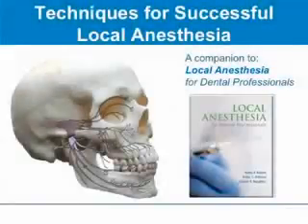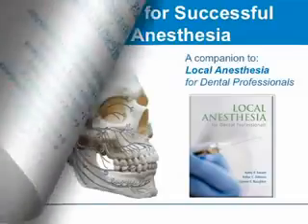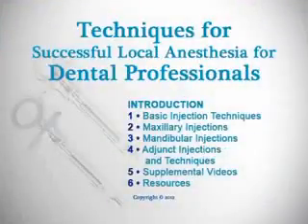Techniques for Successful Local Anesthesia was developed in conjunction with the authors of the textbook Local Anesthesia for Dental Professionals as a companion to the text and is calibrated to the recommendations and guidelines specified throughout. Techniques for Successful Local Anesthesia also breaks new ground as a well-designed, standalone review for clinicians of local anesthesia. This DVD provides clear, easy-to-follow visual learning components divided into several units.